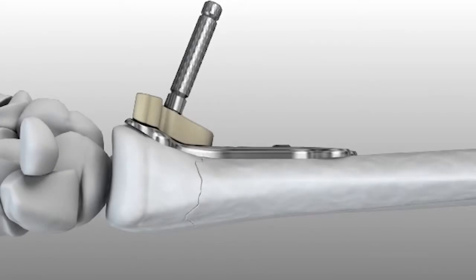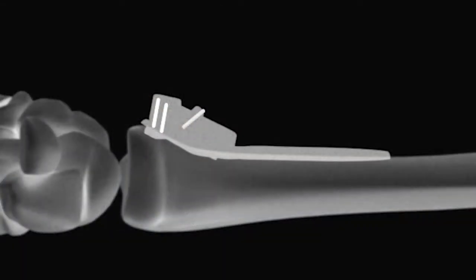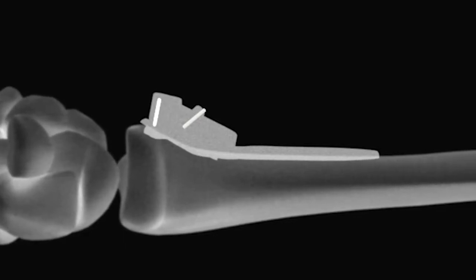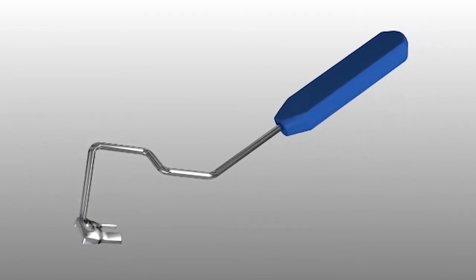To verify plate placement from a lateral view, line up the 2 parallel radiopaque posts. A single plane is created by the goal posts beneath the subchondral bone, showing trajectory of the distal screw row. If the posts do not target into the joint, then the distal screw row will not either. This can be achieved by lifting the hand in neutral rotation so that the forearm is 20 degrees to the OR table. A plate positioning handle is also available in the Acculock 2 system.